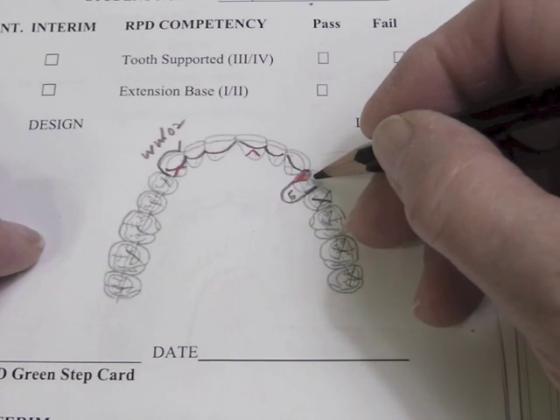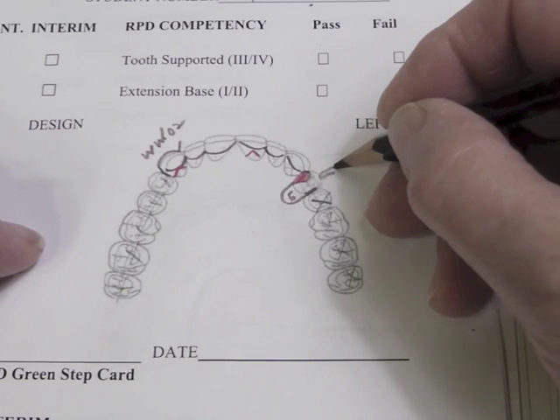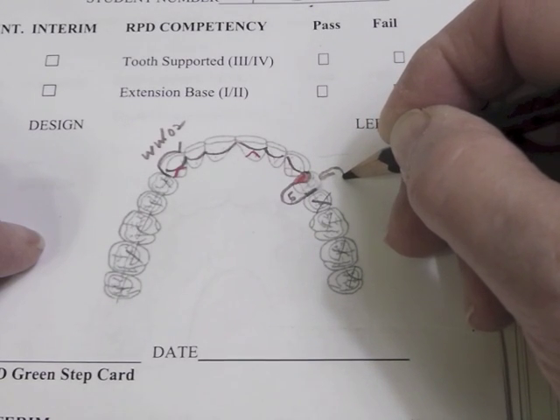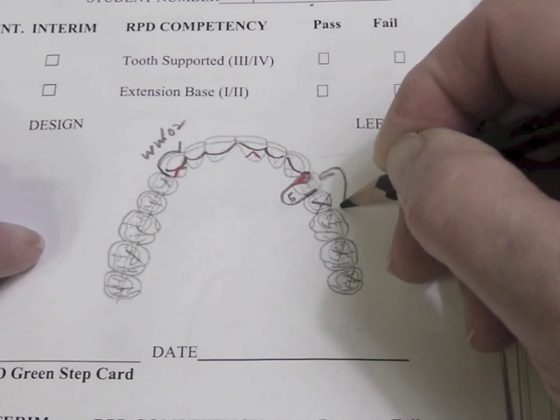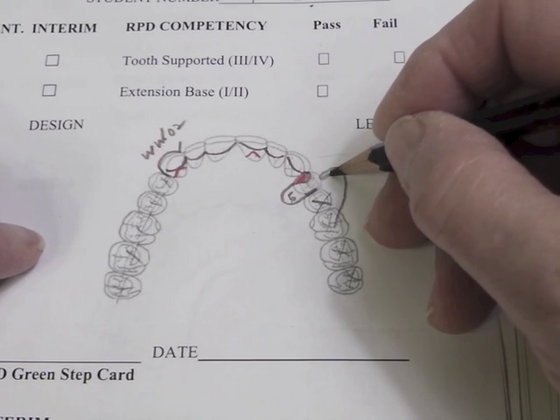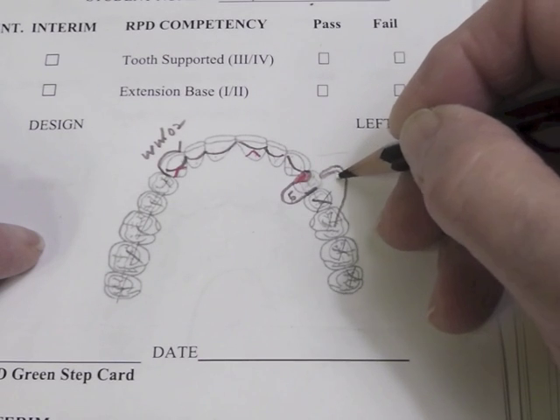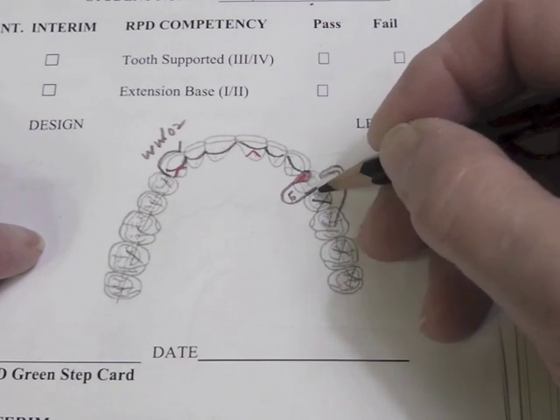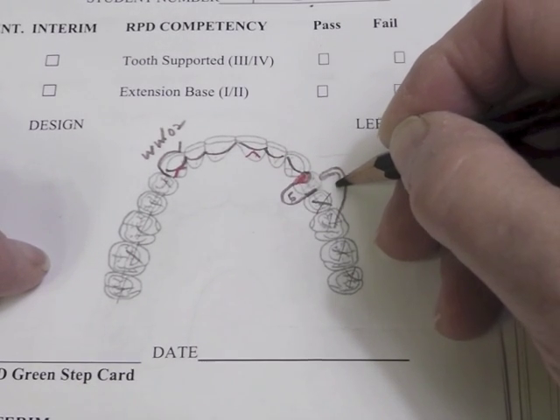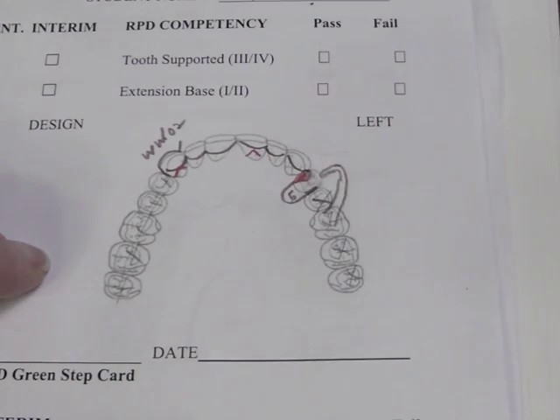The eye bar comes straight up the middle of the tooth buccolingually and goes into a 0.01 undercut. It goes down the front of the tooth and at the six-millimeter mark it can swing posteriorly, and then it needs some length so that it will flex. It's only about two millimeters wide at that area and only about two millimeters wide where it emerges out of the base attachment, and it's wider at its origin than at its terminus.